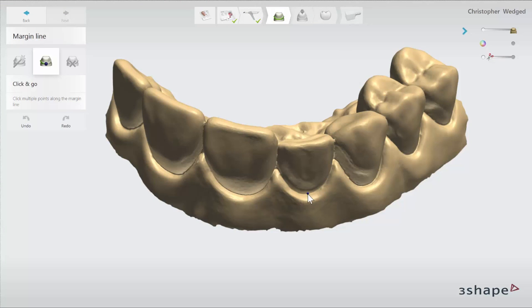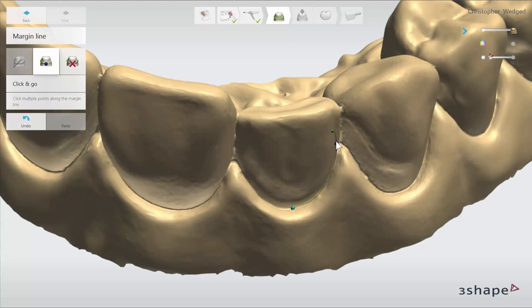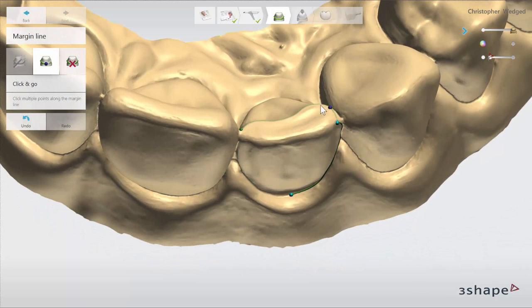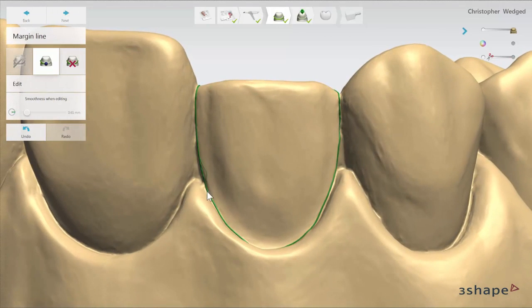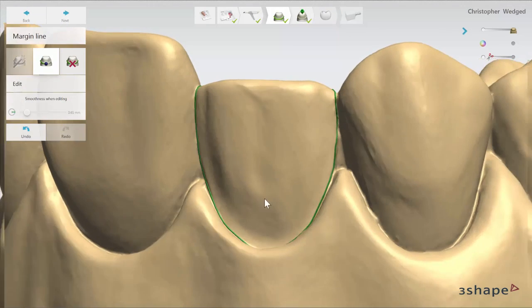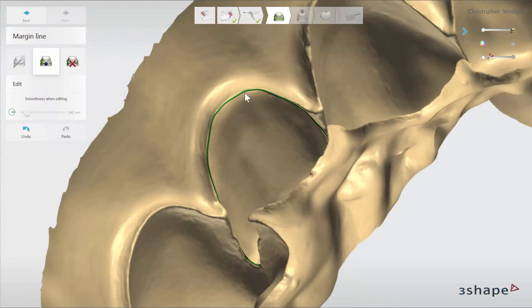You will need to place the first point on the margin line and then several others on the way until you make a full circle. When you place a point the line will always follow the sharpest edges to give you a proposition for further steps. When you have placed the margin line you can always adjust it by dragging it to a chosen point. Adjustment is possible from positive and negative sides of the scan.